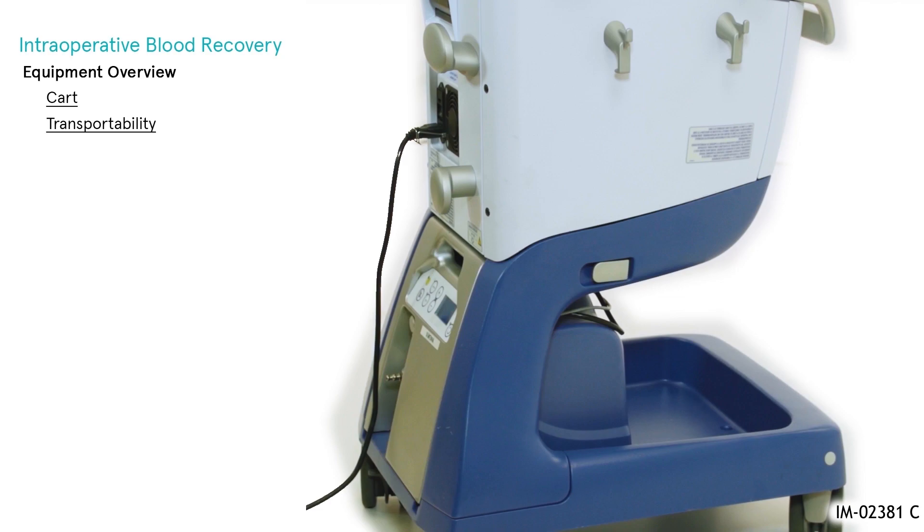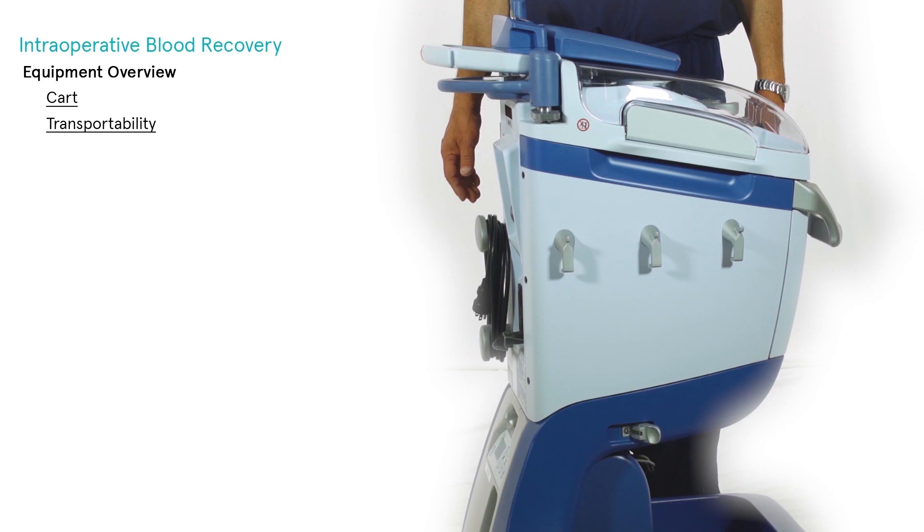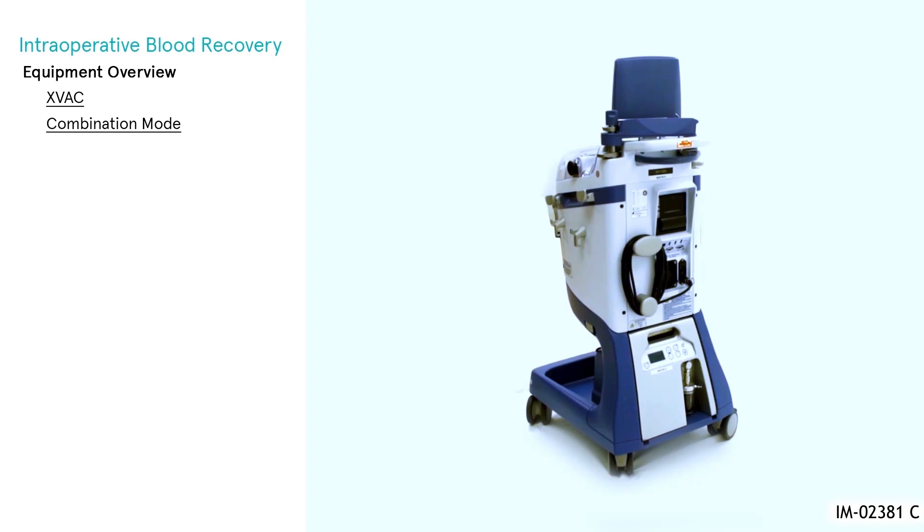If transport of the device is required, the Extra body can be detached from the cart by means of two spring levers located on each side of the cart. When detached, the body of the machine can be lifted using the rear transport handle and the front handle together.